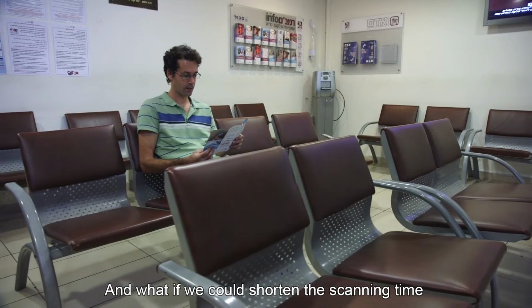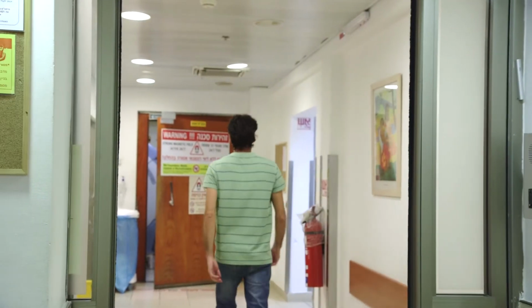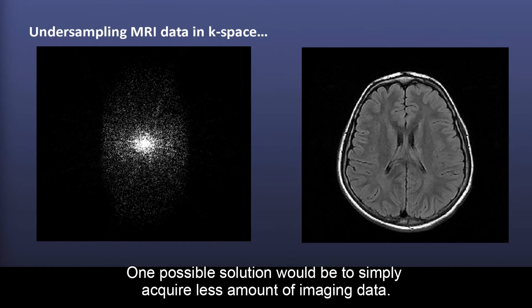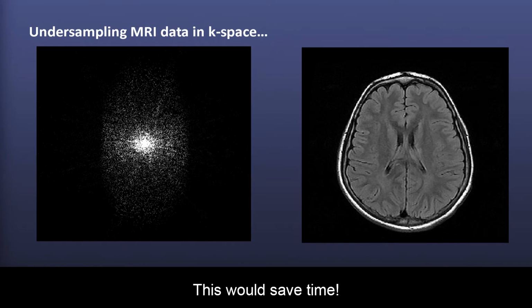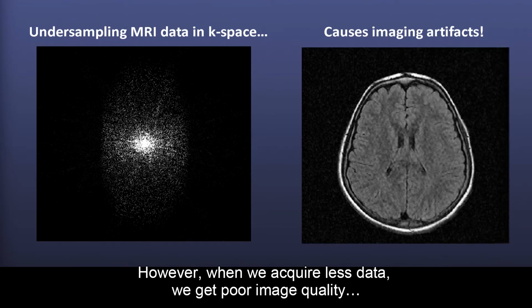And what if we could shorten the scanning time and provide the same images at the same quality? One possible solution would be to simply acquire a less amount of imaging data. This would save time. However, when we acquire less data, we get poor image quality.